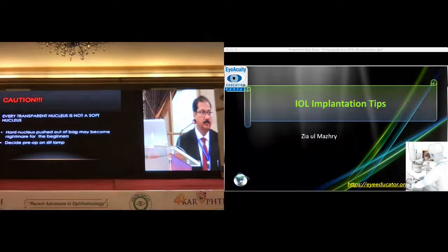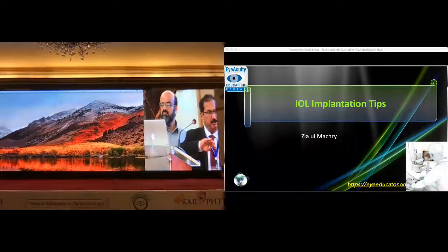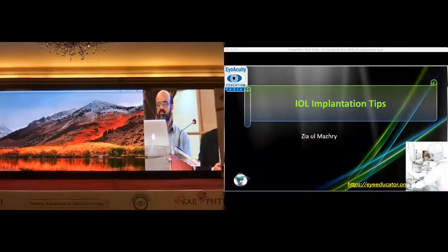Can I comment? You are treating the phaco correctly. You are not staying in the center — you are going towards the periphery. That's what I was telling you in the beginning: you have to peel your bevel towards the edge of the nucleus, towards the periphery. You have to tilt the bevel so one side goes upwards and one goes downwards, then push. You have to create a space, keep it in the center, and then push the capsule backwards. This is the only way — otherwise you will be in trouble.